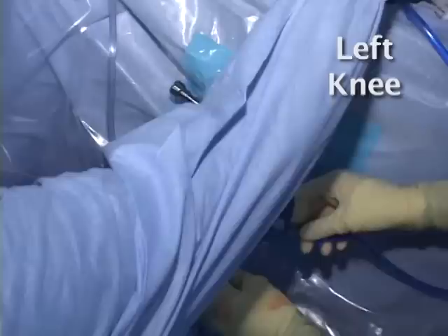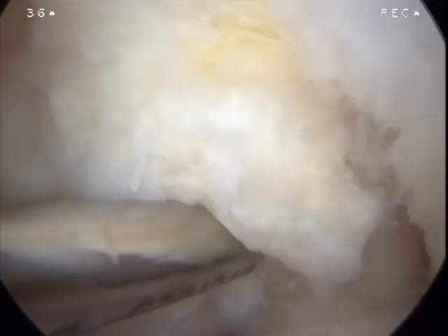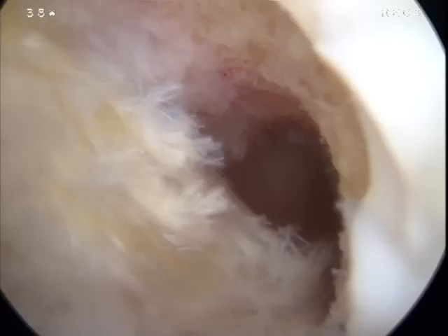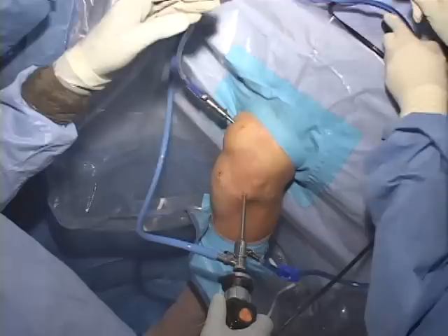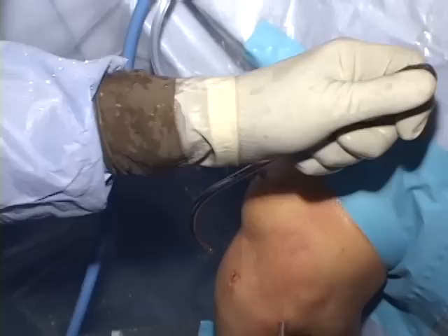Our technique of ACL reconstruction involves what we call a three-portal technique. After arthroscopic treatment of other problems within the knee, such as treatment of articular cartilage defects and torn meniscus cartilages, the ACL is approached by first cleaning out the intercondylar notch, taking care to obtain excellent visualization of the ACL insertion sites on the tibia and on the femur. Wall notchplasty is performed only if necessary to improve visualization or if there is a particularly tight intercondylar notch.